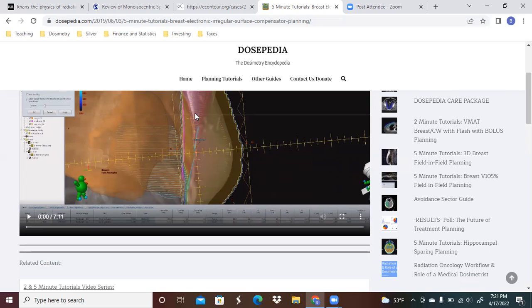In other words, you want a little bit more dose here and a little bit less here, and hopefully at the end you end up with something that is more of a Van Gogh as opposed to a paint by numbers that I would do. So that's one of the more complex forward planning types of plans that can be put together.